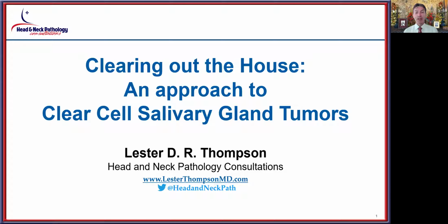I'd like to talk a little bit about clearing out the house and approach to some clear cell salivary gland tumors.